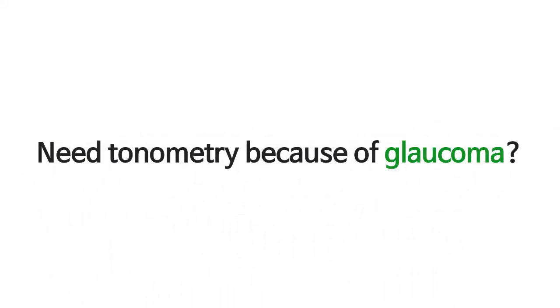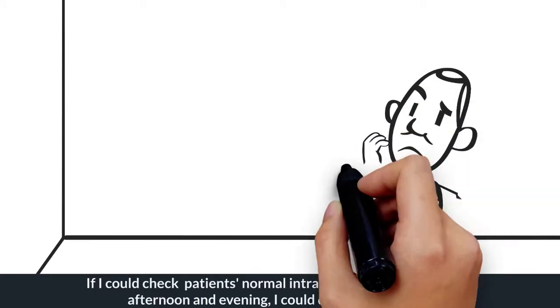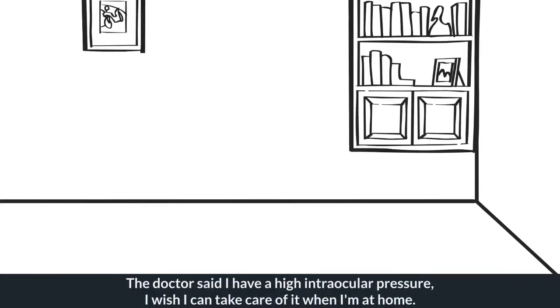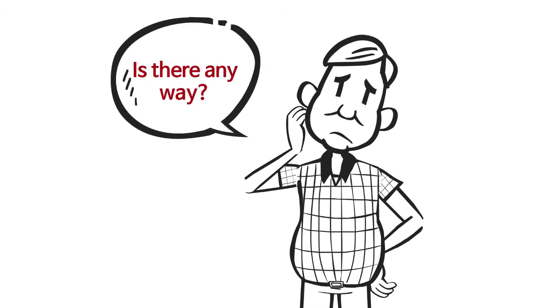Need tonometry because of glaucoma? Need intraocular pressure care? Have a problem that you can't check your patients' intraocular pressure out of the hospital? If you could check a patient's intraocular pressure morning, afternoon, and evening, you could diagnose properly. The doctor said I have high intraocular pressure and I wish I could take care of it when I'm at home. Is there any way?